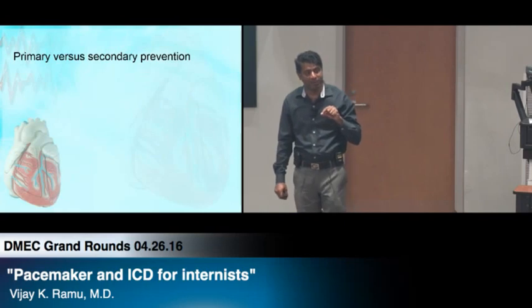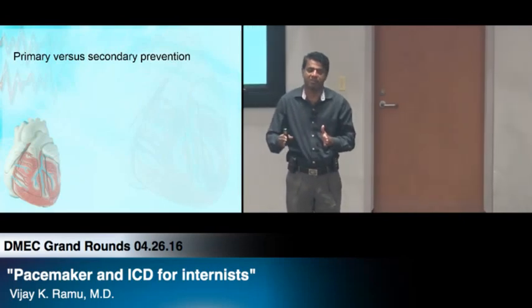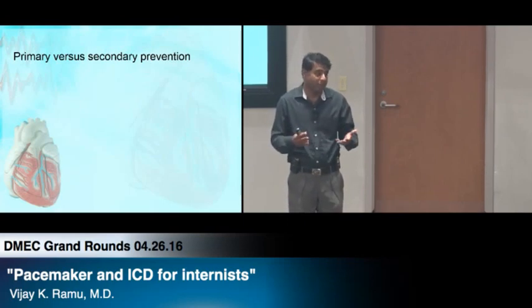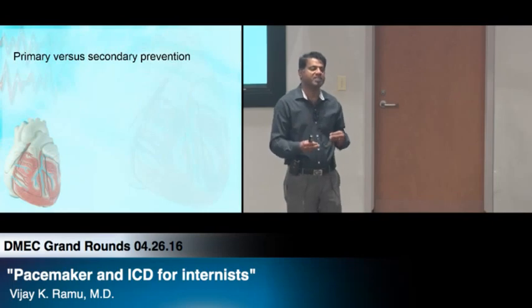For you to get a defibrillator, you have to have an event, and you survive that event. It's usually a survivor of a cardiac arrest, or a long QT interval, or HCM, or something. Those are the ones who got ICDs. Many people don't survive, so they don't get an ICD. So it was not a common diagnosis. Then the evolution was, how could I put an ICD to save somebody?